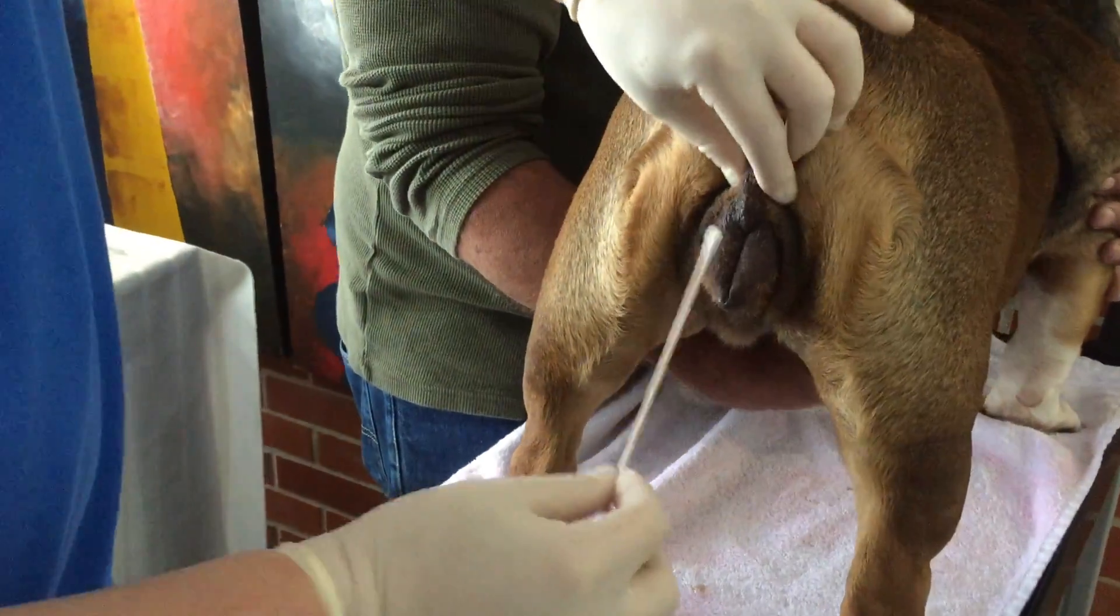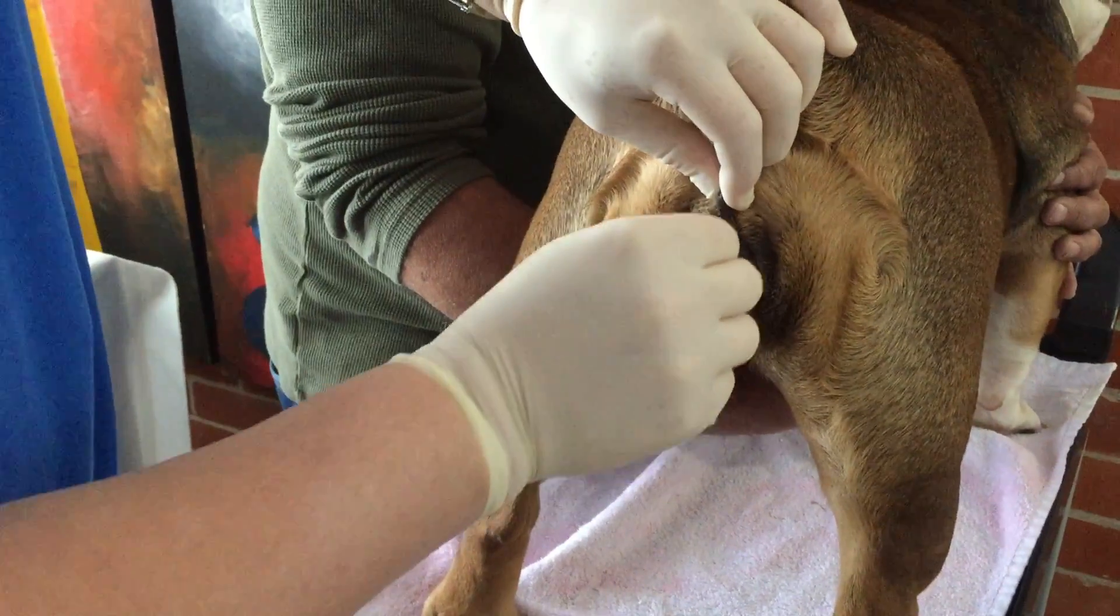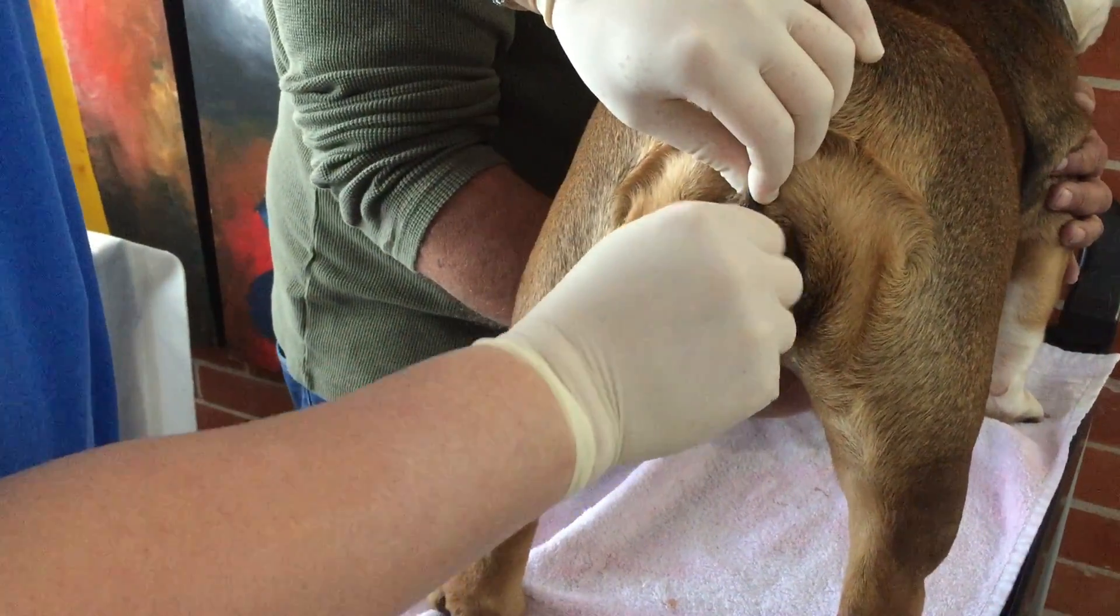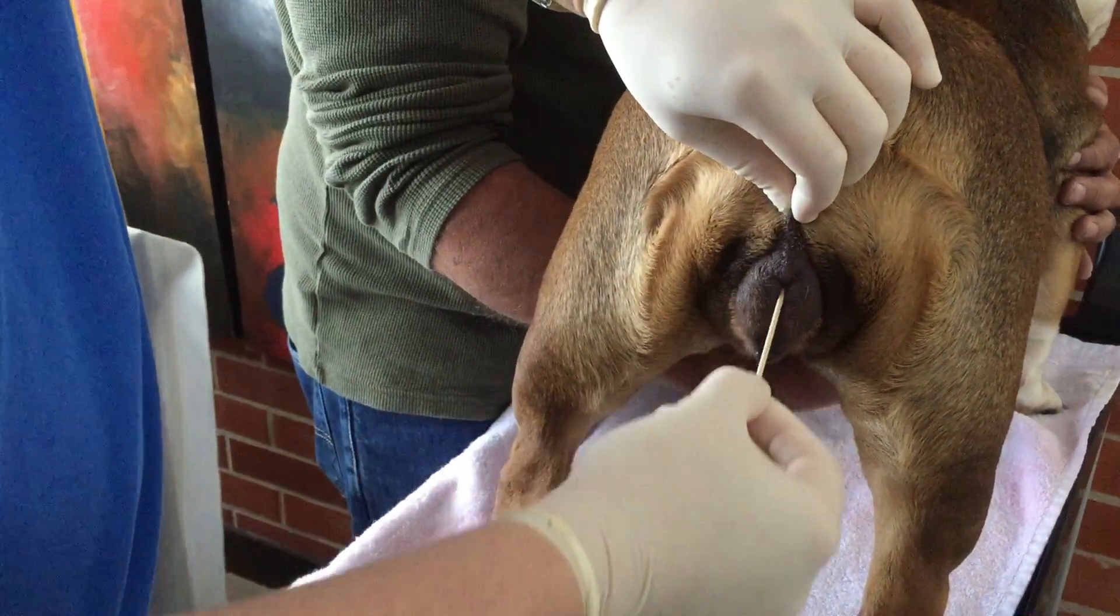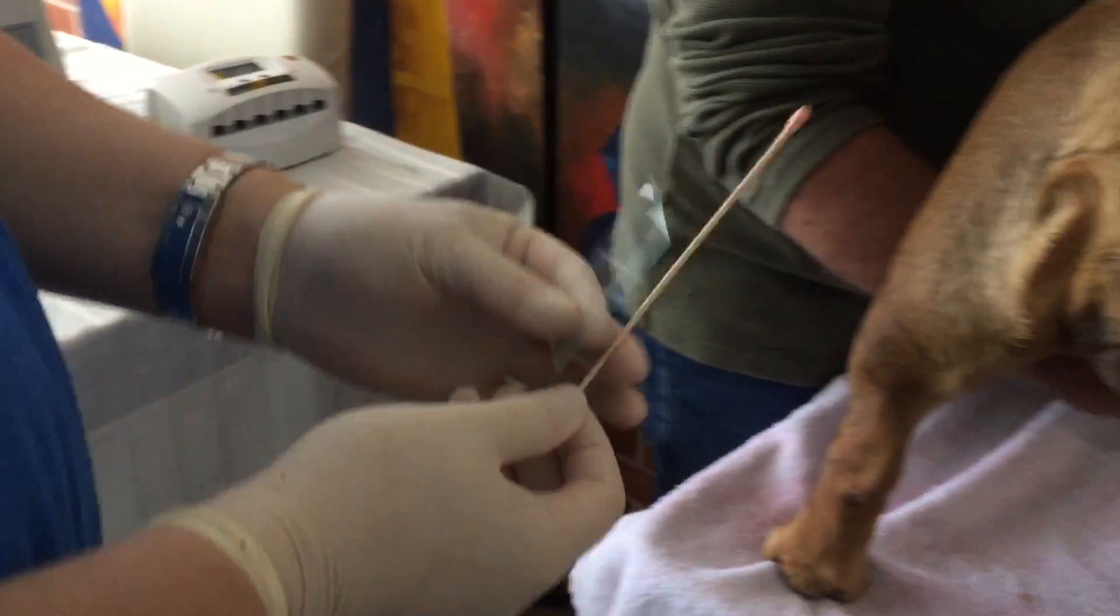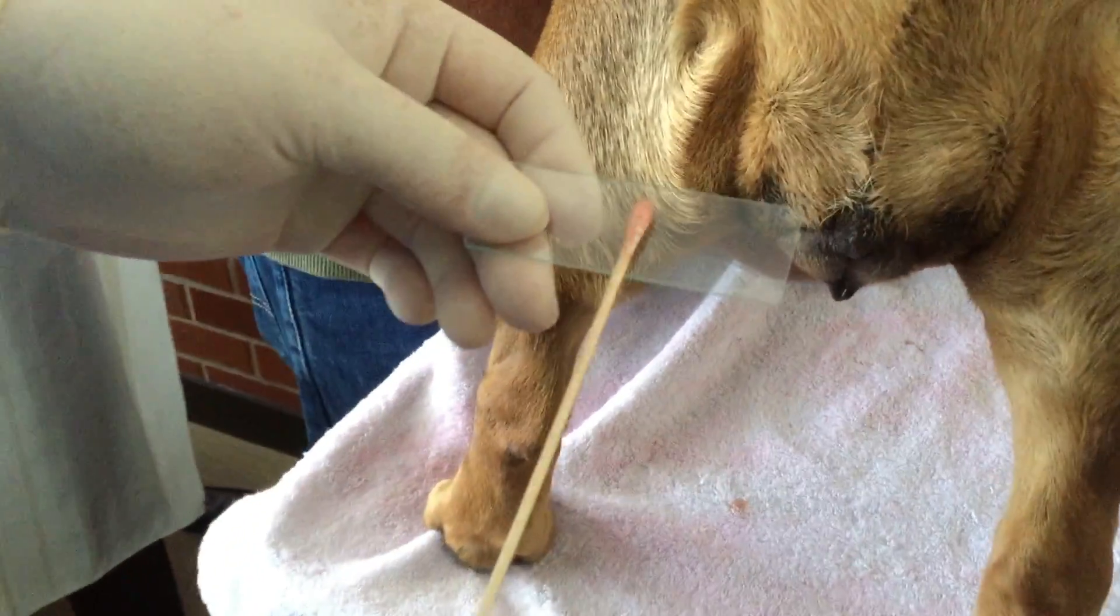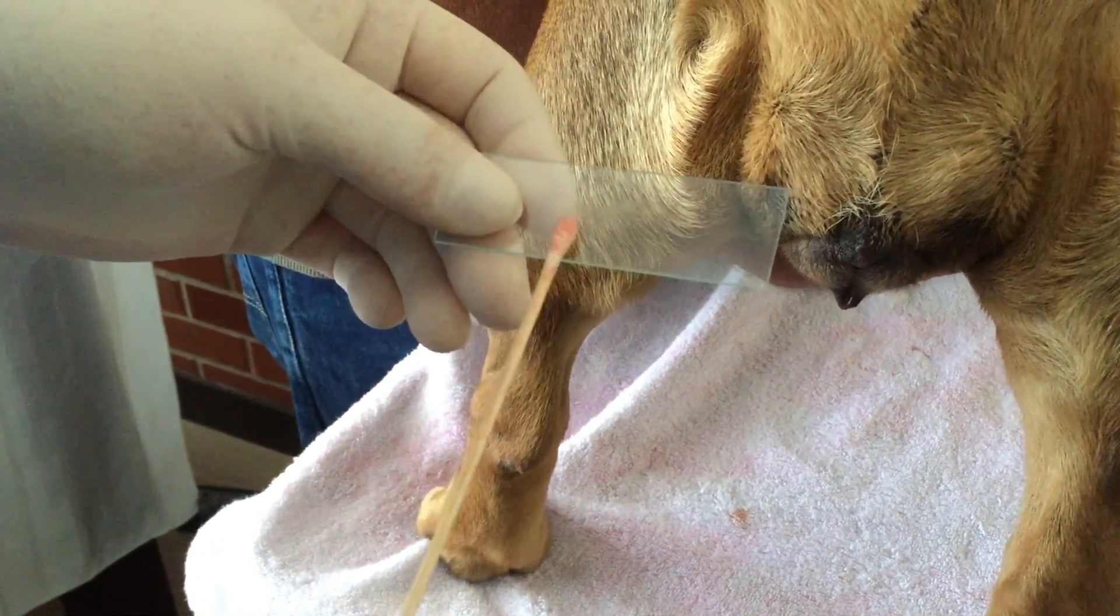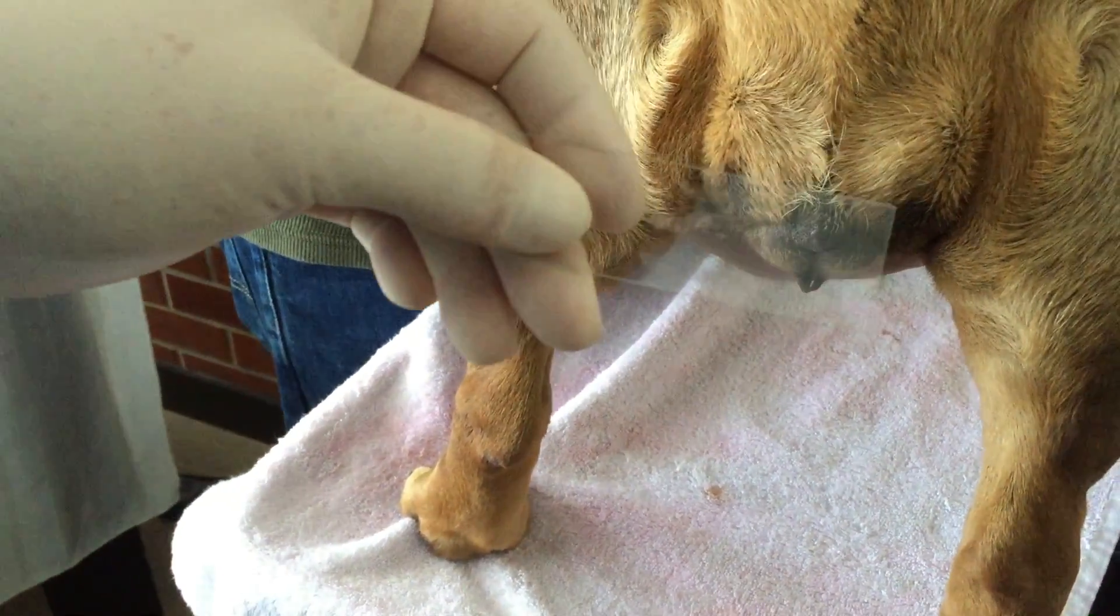We're going to see the smear under the microscope in a second. Let's go stain this.